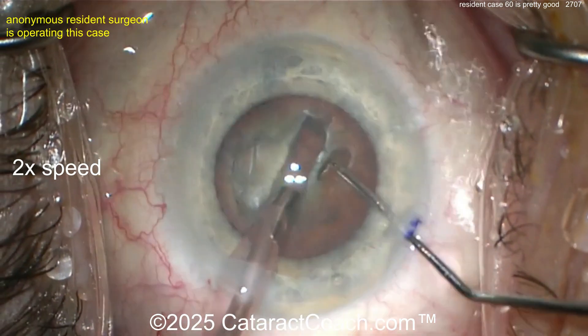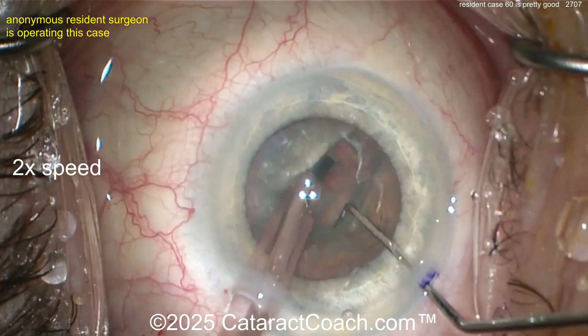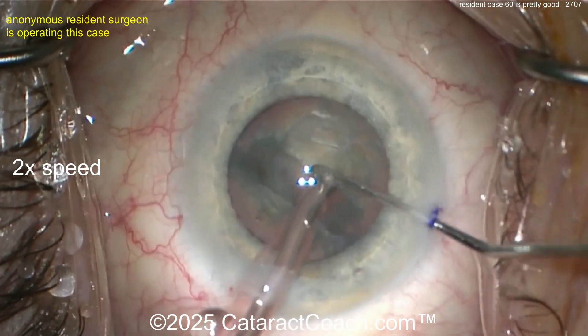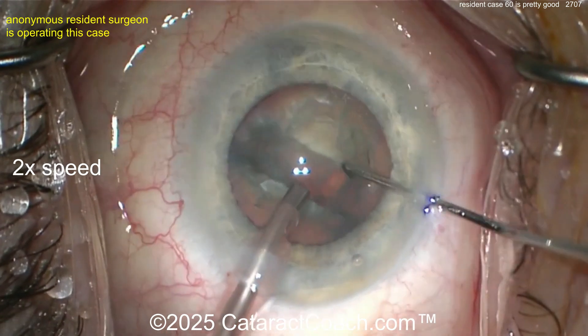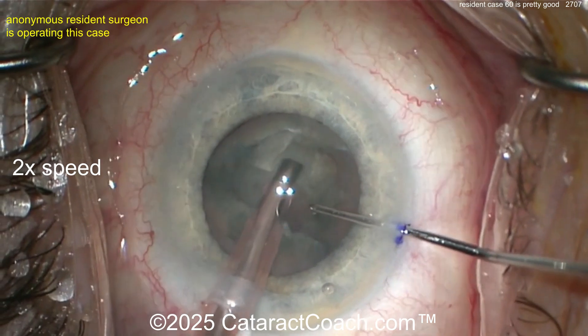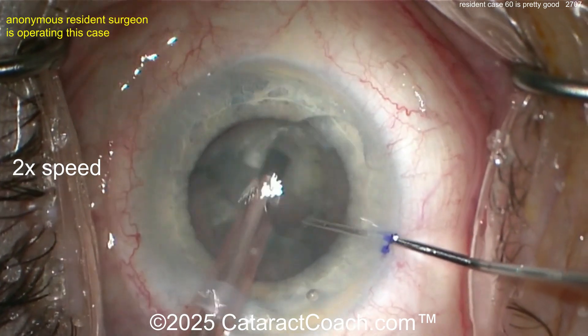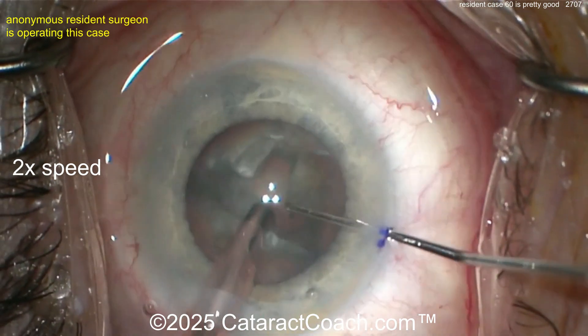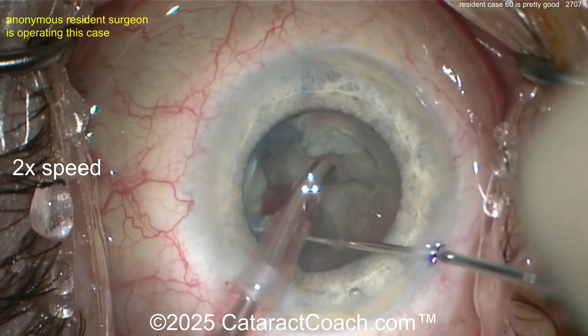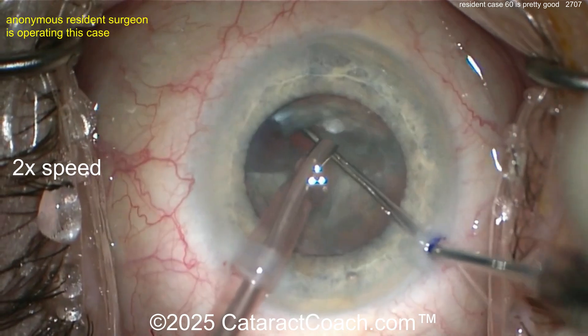I think you're pretty sufficient on the depth there. Let's get the second instrument inside the eye — let's see which way you're going to do it. Direct action — nicely split into two halves. Rotating that around, make sure it's fully split. Now let's see — are you going to do a chop or another groove? Another groove — so you're doing a divide and conquer, which is a very reasonable approach. But at this point, you're pretty good at the divide and conquer — maybe it's time to advance to stop and chop.